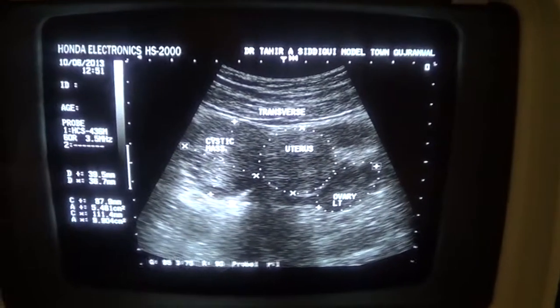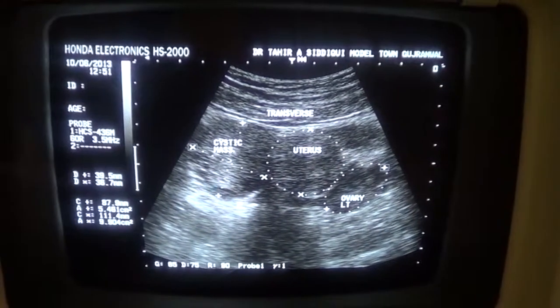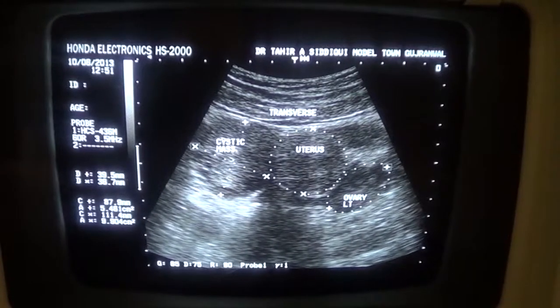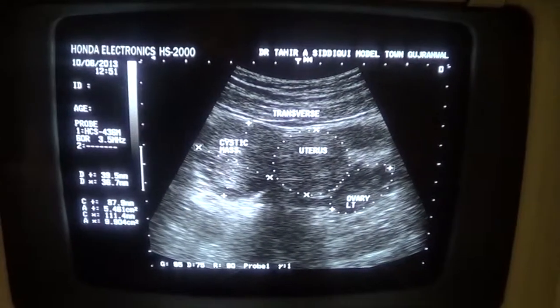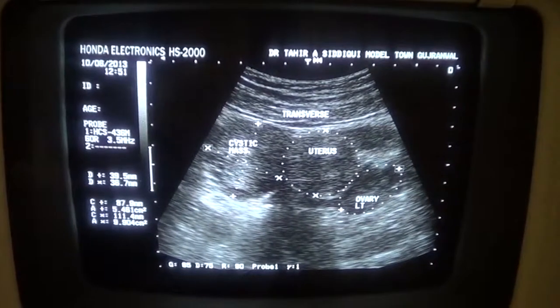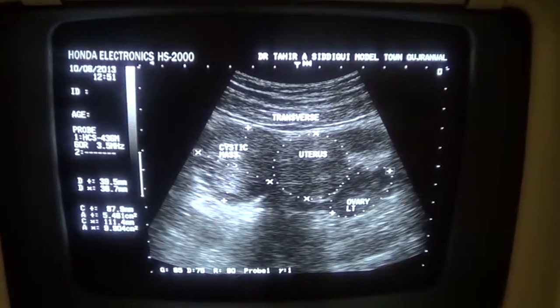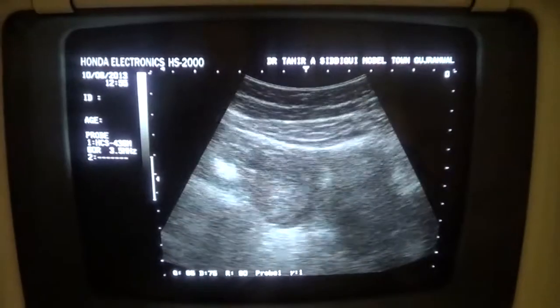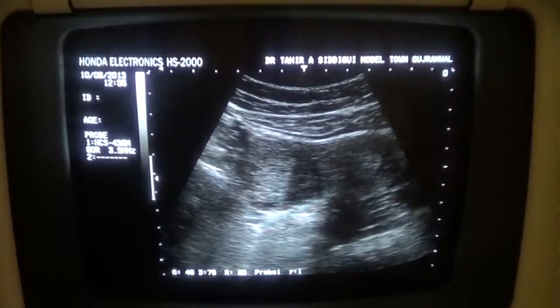an ovarian cyst with a bleed within it that has, with time, become a clot within the cyst. Now let's study it. This is the cystic area.